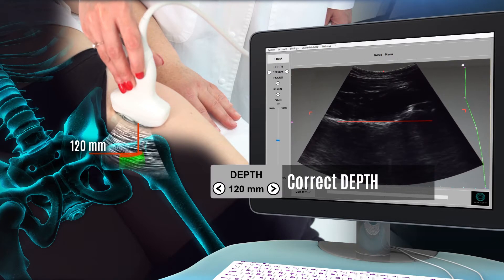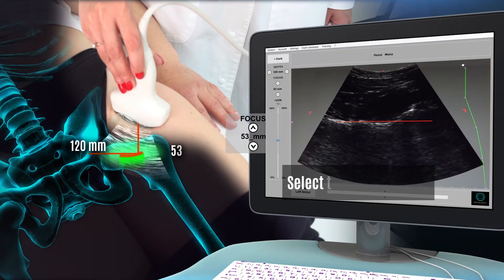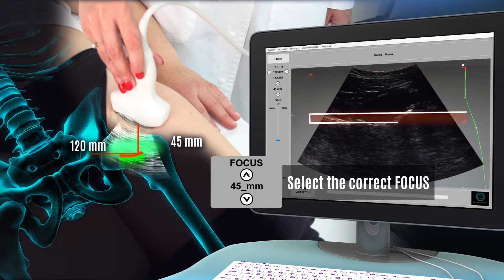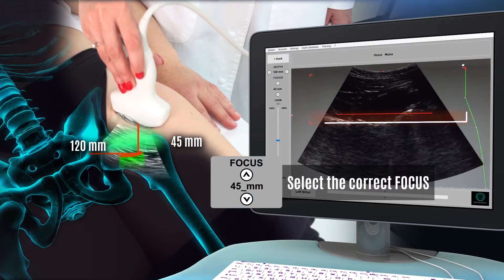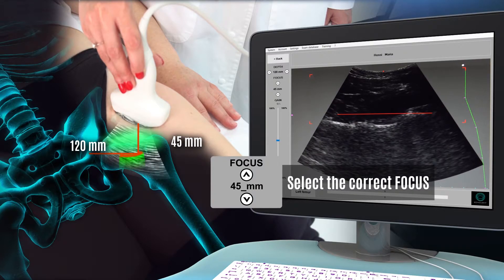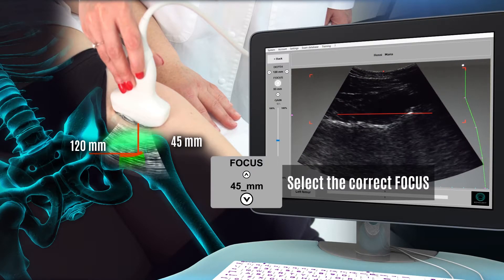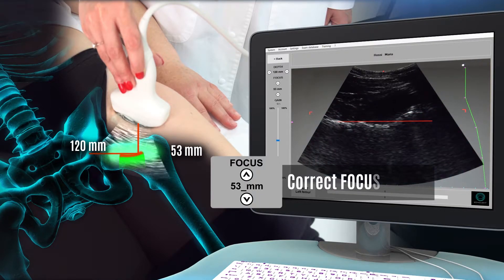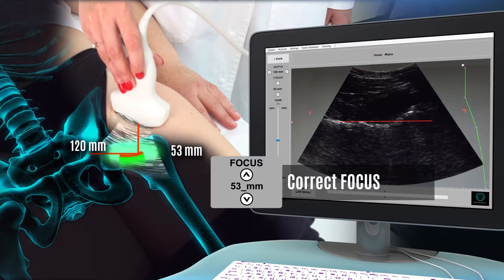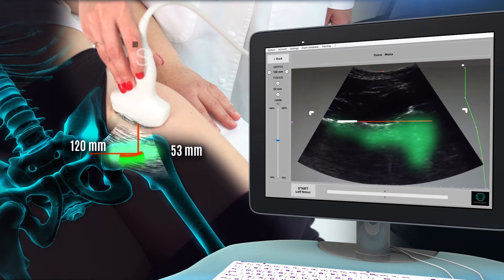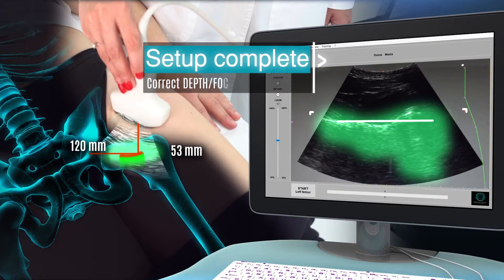After identifying the depth value, select a focus. The focal area is marked by red angles and the main focus point is the red horizontal line. Set the correct value choosing from those available to view the bone interface within the focal area, with the femoral neck under the red line at the same time.